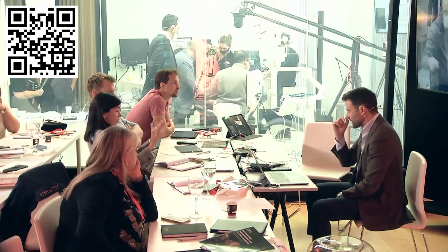So usually you see the mistakes on the immediate loading. The day after, when the patient is no longer anesthetized, or next week, whenever you see the patient and you see that the teeth are a little bit shorter, maybe we can start taking these pictures at that moment. So we fix the problem, and the aesthetic comes better. That's usually what happens.